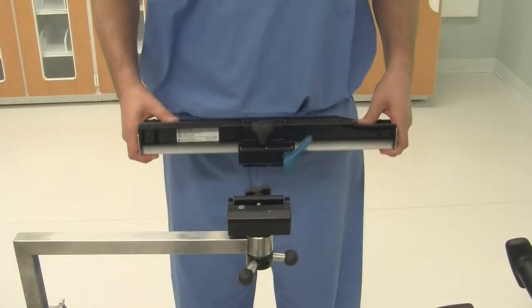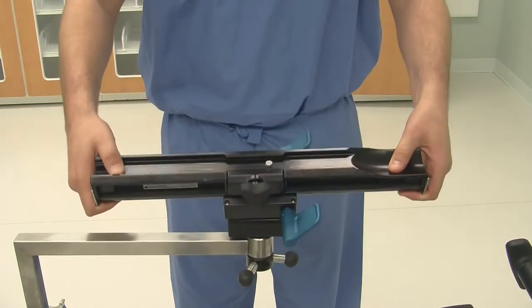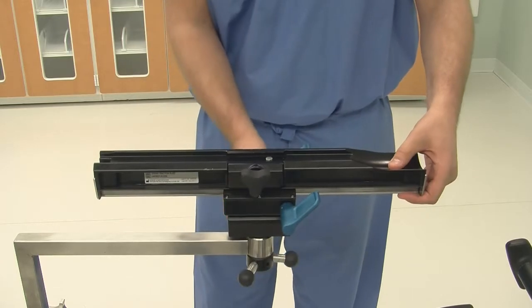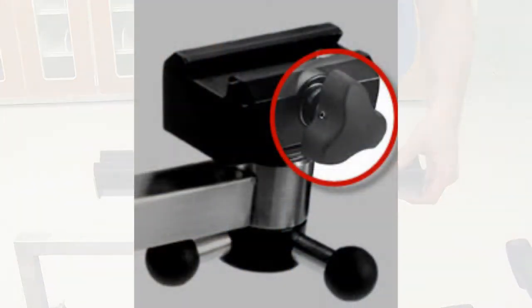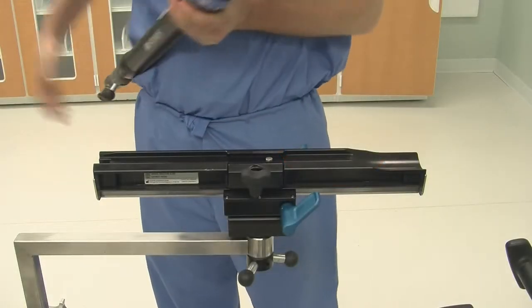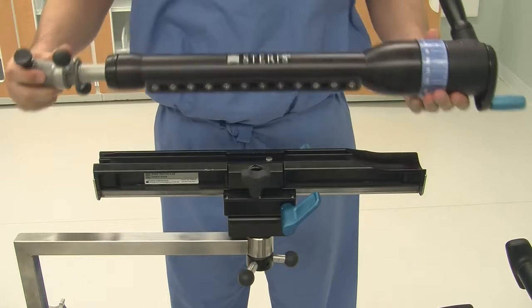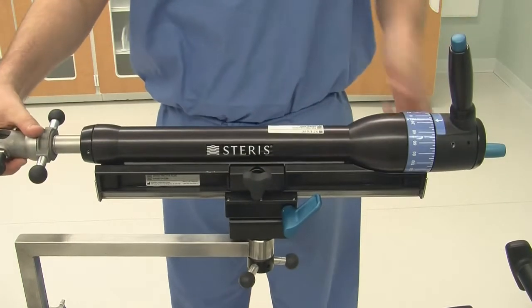Now, add the gross traction slide mechanism to the clamp and tighten the locking knob. Next, attach the fine traction assembly onto the gross traction slide mechanism and tighten the locking knob.